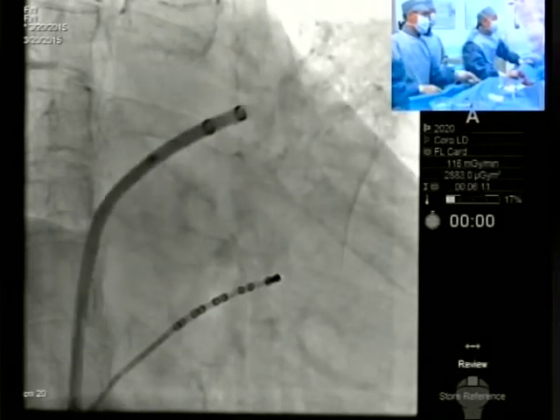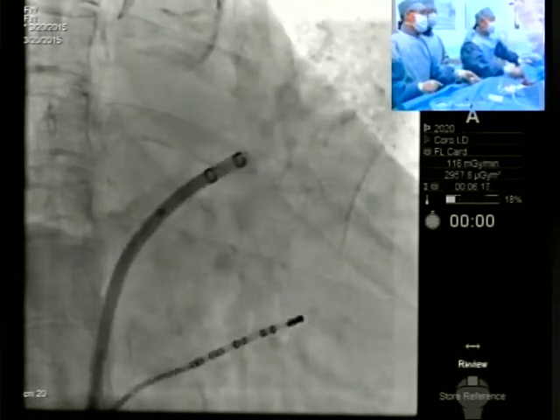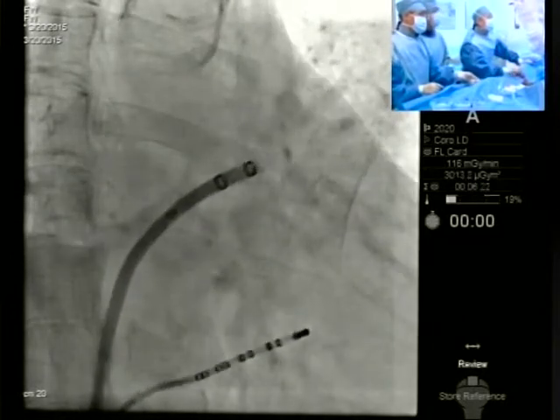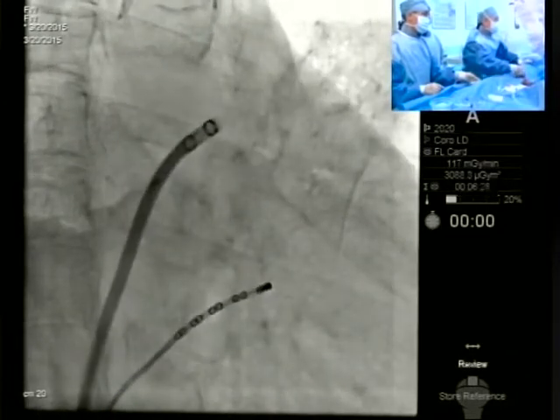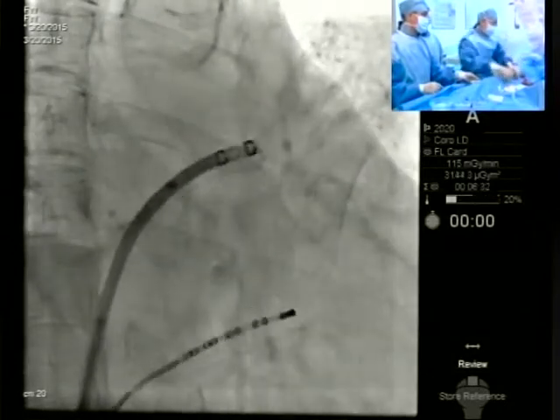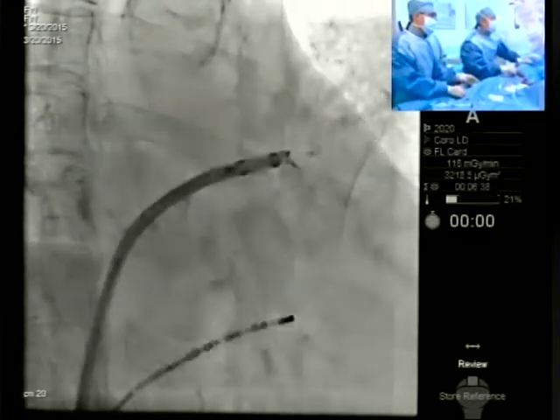Yeah. It's pretty close to the roof now. I would not advance it there. Maybe counterclockwise rotation may bring it down. Yeah, but the catheter doesn't turn. I try to rotate clockwise. Jarwin, another way is don't push the catheter. You partially open the device here, then you will fall down a bit due to gravity, and then you can gradually push in the device. You are now really pushing hard to the wall, yes. Okay, that's about right.